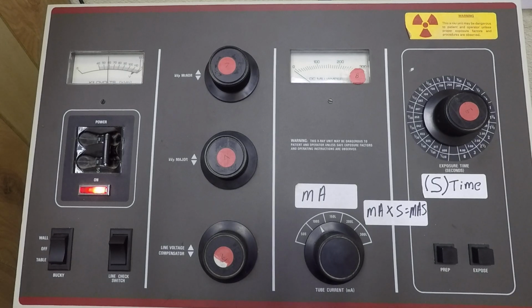We know that in the X-ray tube we have a high potential difference from cathode to anode, which we generate a space charge of electrons. Those fly across the gap from cathode to anode in the tube, hitting the anode and decelerating the electrons, generating X-rays. So we control all of that from our control console. At least we control quantity.